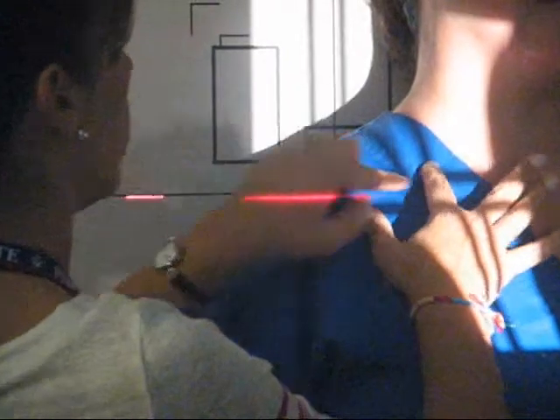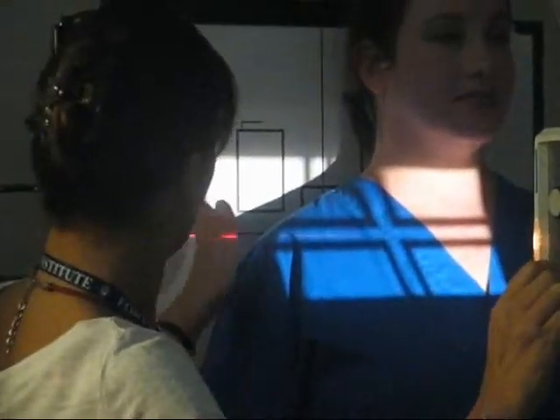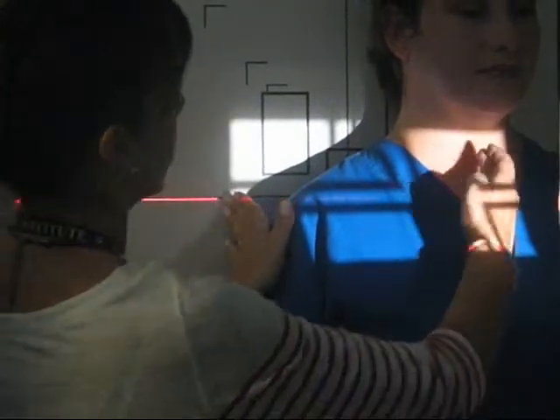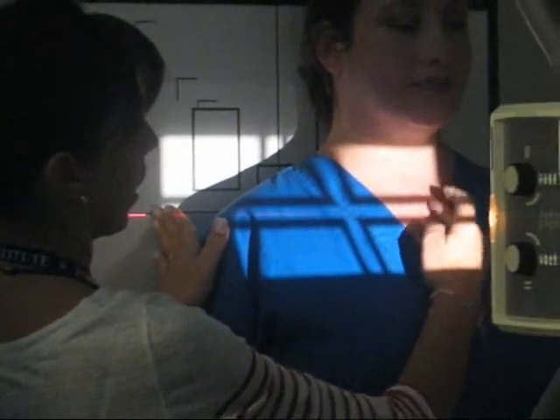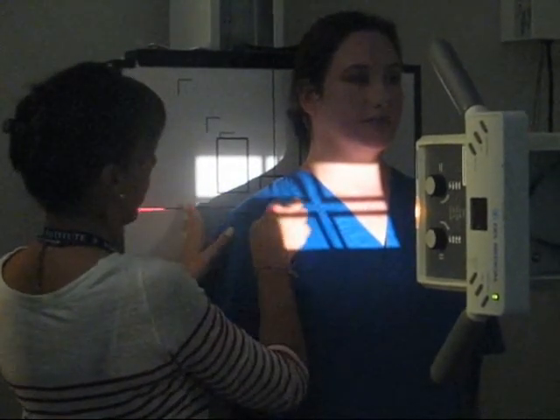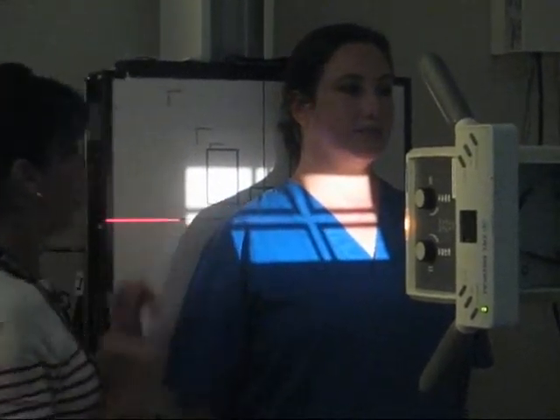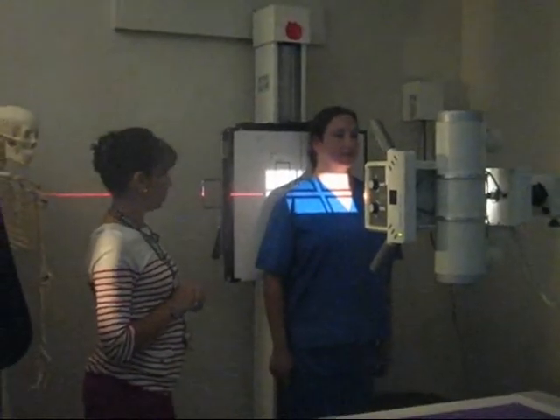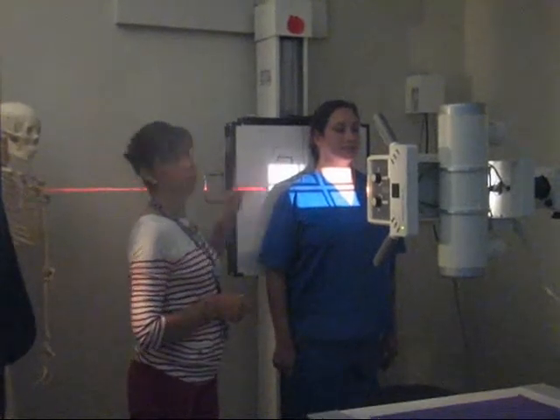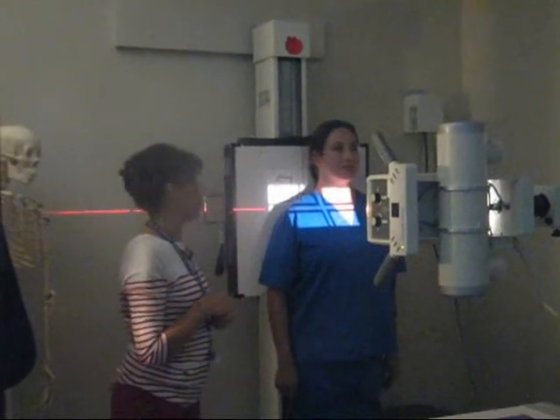All right. So here's the middle of my scapula. I'm going to open it crosswise. And as you can tell by the shadow, there's her sternum, so I definitely get her connection with the sternum, and here all the way the connection with the humerus. So I get all her clavicle. Make sure that your right marker is not going to be in front of any of the body parts of interest.